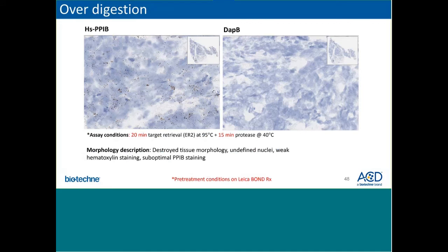As compared to the last slide, this data set shows tissue that has been over-digested, in which the nuclei are now undefined due to suboptimal tissue morphology, and the PPIB staining is slightly weaker than expected. Again, please note that these conditions were done on the Leica BOND Rx.